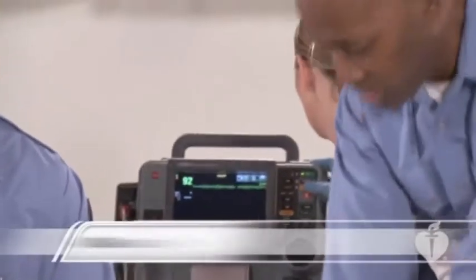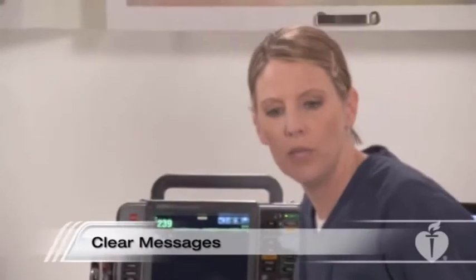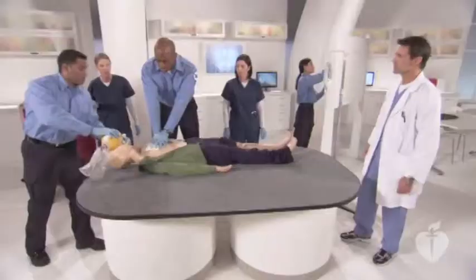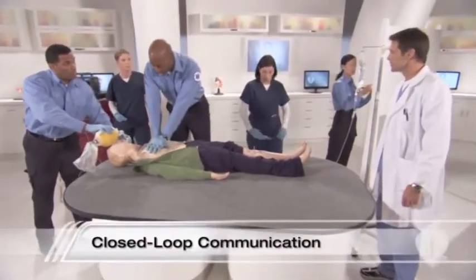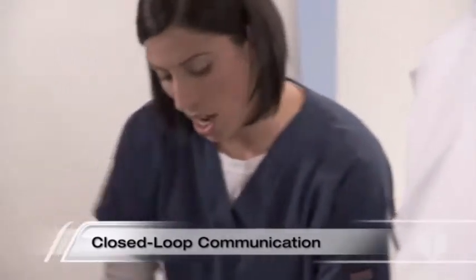Charging. Clear the patient. Shocking on 3. 1, 2, 3. Shocking. Shock delivered. Continue CPR. Continuing compressions. Dana, please give 1 milligram of epinephrine. 1 milligram epinephrine. And the IO is flushed.